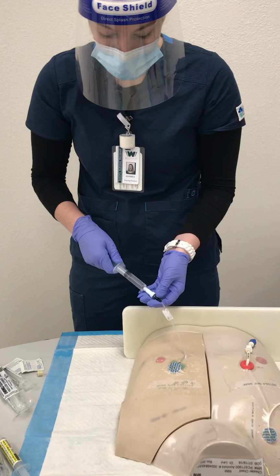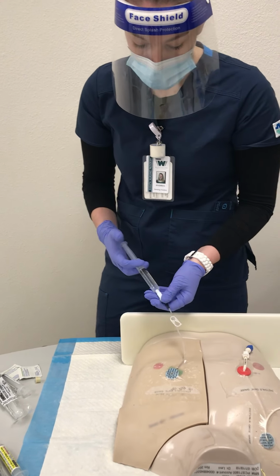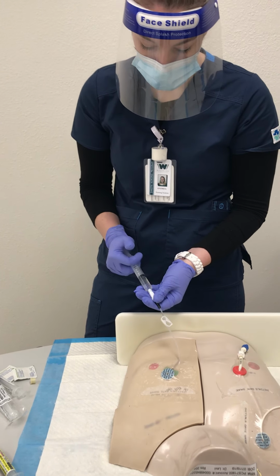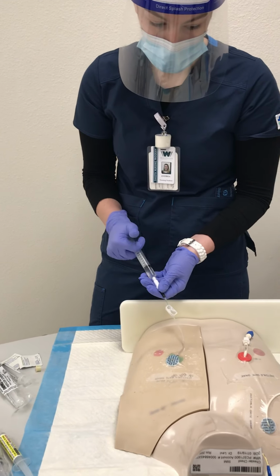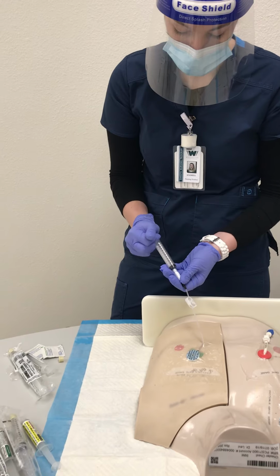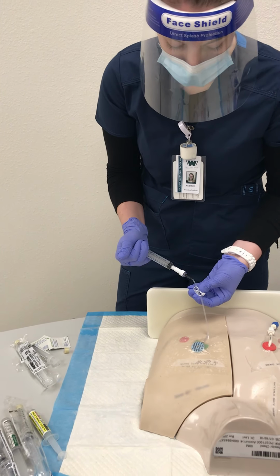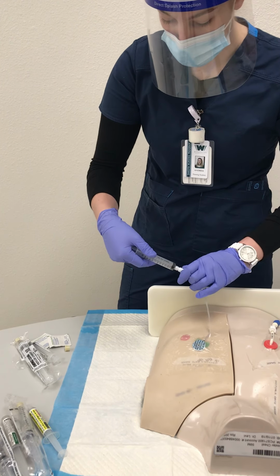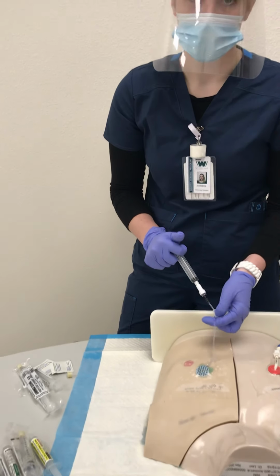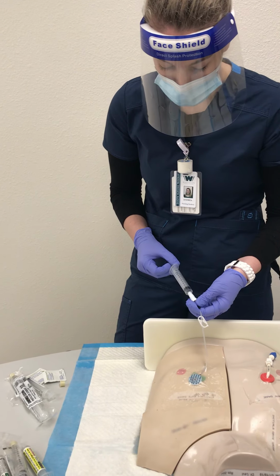And then we want to aspirate until we see some blood return, and I see some blood return coming up. So now we can do a push-pause method to administer this flush. So once that's administered, I'm going to want to keep my hand on the plunger and lock. And then I can also withdraw with the same syringe. So once that's gone through, I'm going to withdraw 10 milliliters of blood.